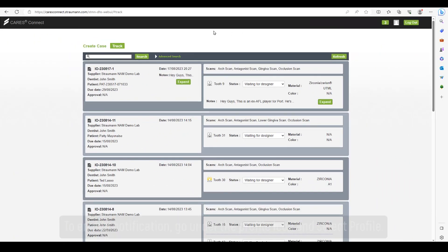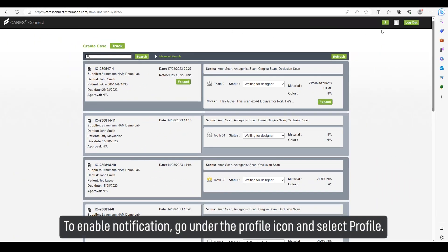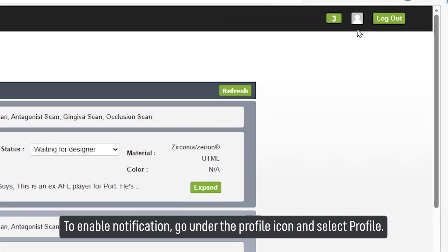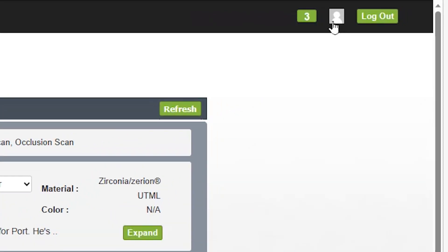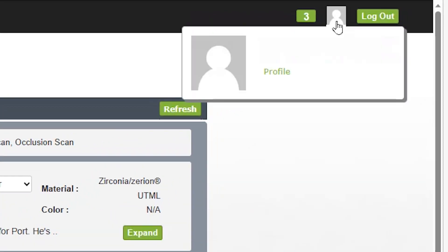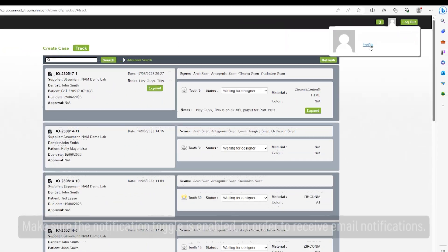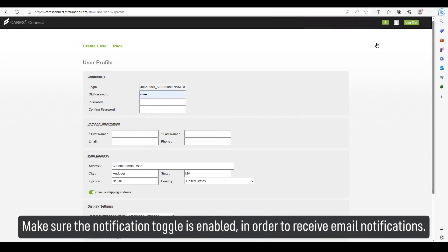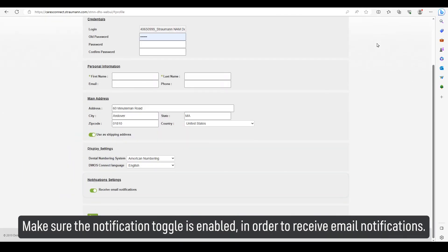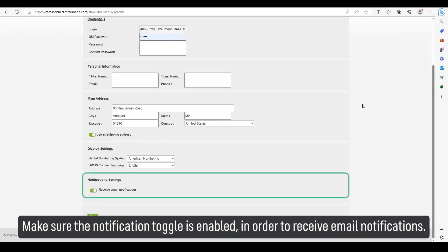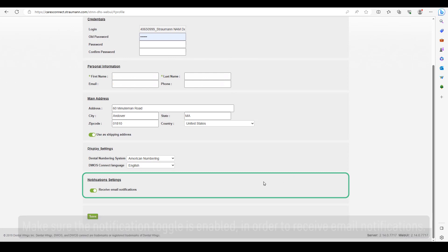To enable notifications, go to the profile icon and select Profile. Make sure the notification toggle is enabled in order to receive email notifications.